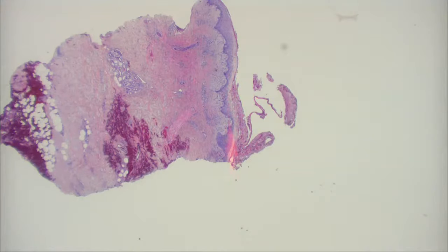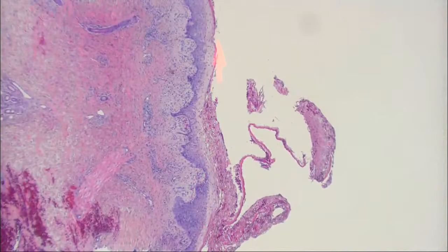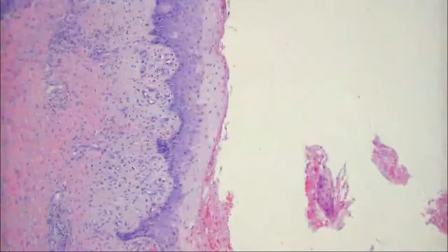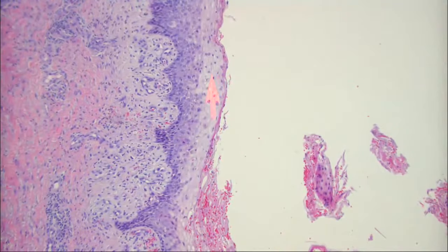So why do you get pallor? And notice where the pallor is located. In the superficial epidermis. Yeah, it's at the top. It's not at the bottom. It's at the top. Okay, so what diseases give you, what's causing this pallor? Stasis. Like edema. Edema. And where is the edema?